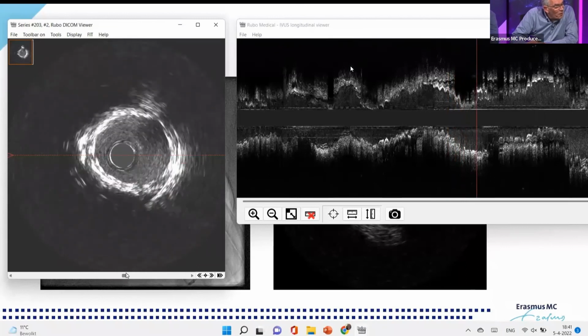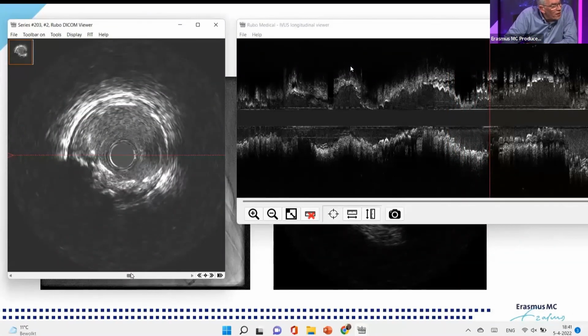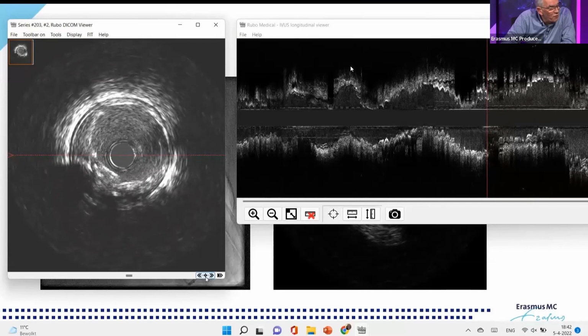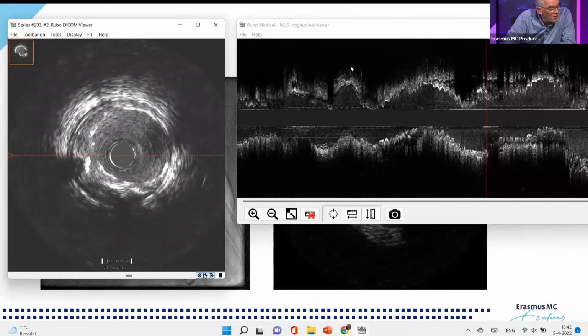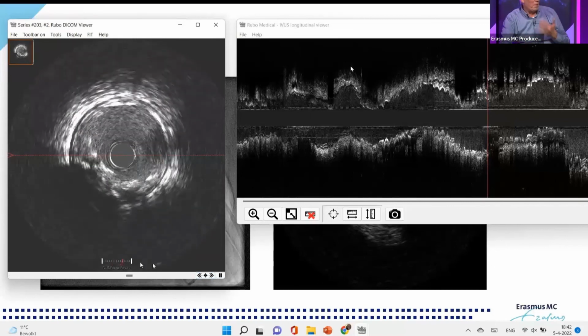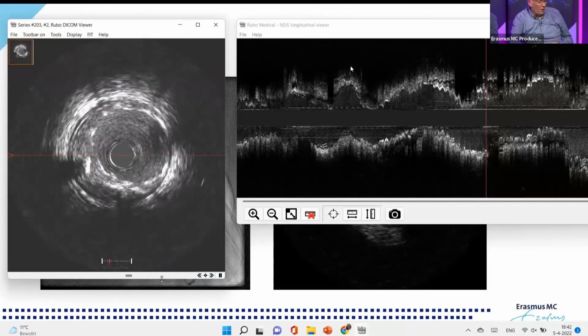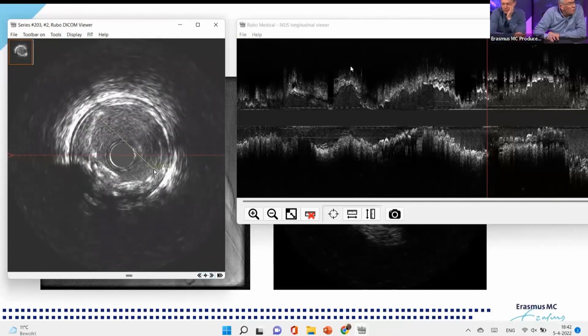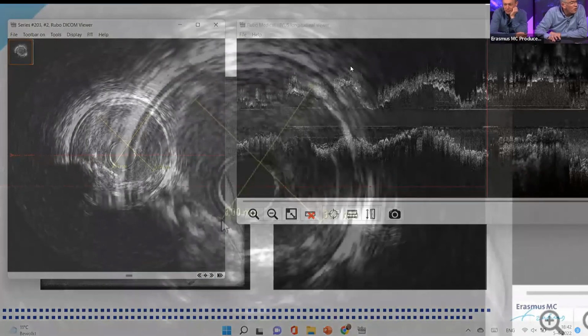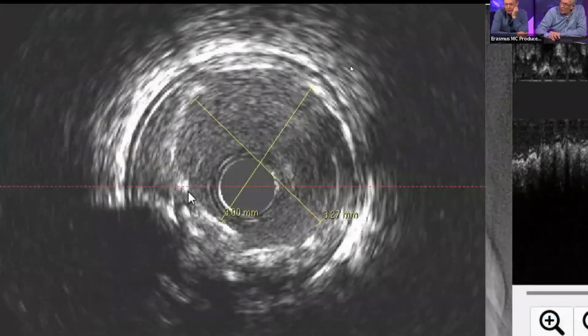So here we see the proximal stent. You can appreciate the region of malposition here that we showed. Did it improve, Jurgen? So we had a 3.5 balloon to post dilate. We measured 3.0. Now let's have a look. Now I will measure 3.20, 3.25. It's a little bit of improvement. 3.3 and 3.0. But you see that you don't get it in here. No, whatever balloon you take, it will not. A balloon is round.